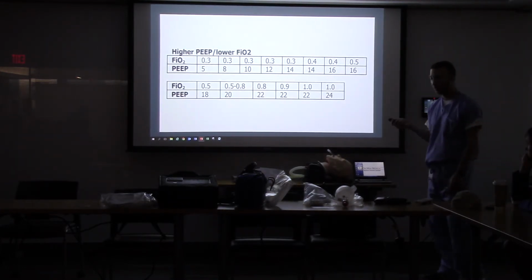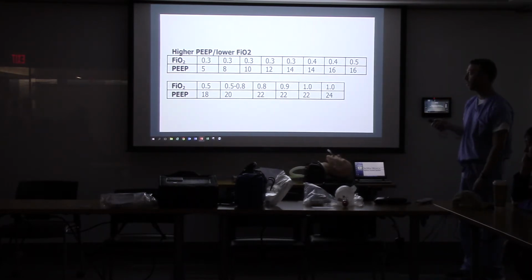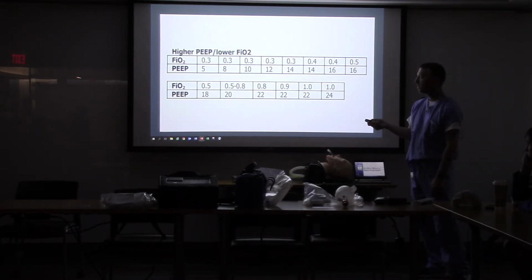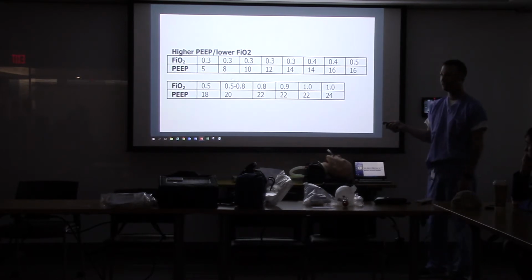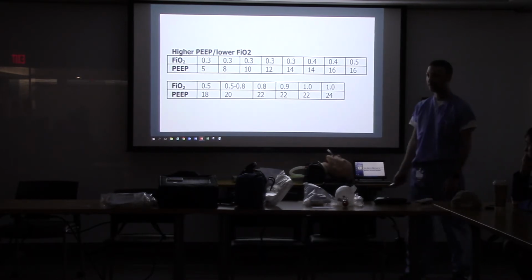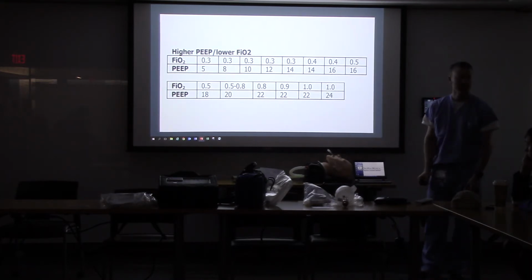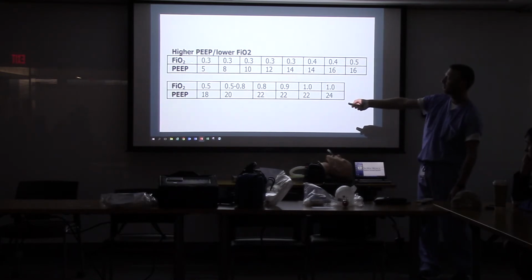PEEP valves. With the lung protective ventilation strategy, PEEP was utilized more. Does anyone know what the fraction of inspired oxygen is in the room right now? What's the percentage of oxygen in the room right now? 21. So that would be 0.21, or right over here.